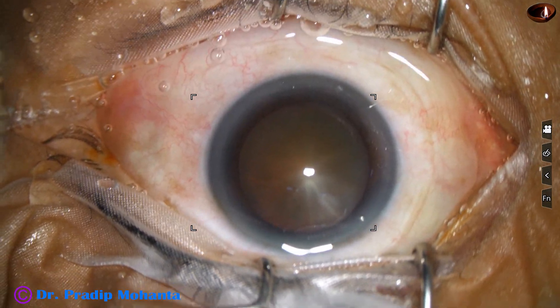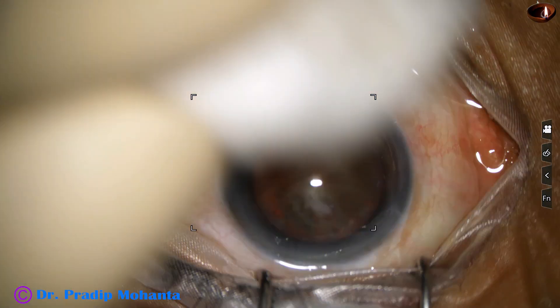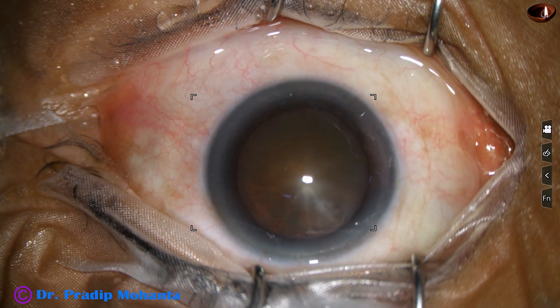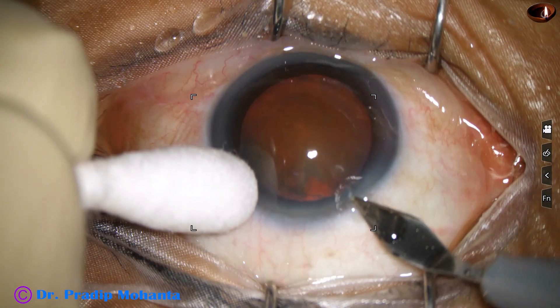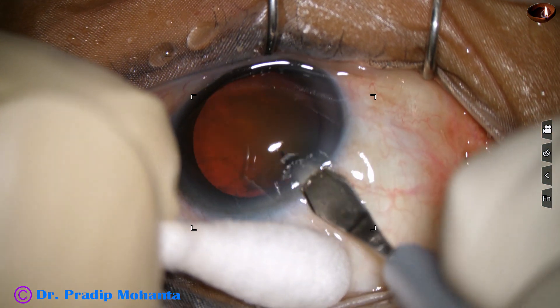The ocular surface has been prepared in the preparation room. Povidone iodine 5% has been applied over the ocular surface, kept for 3 minutes and then washed out with antibiotic drops. This is just a running wash of the ocular surface with BSS.